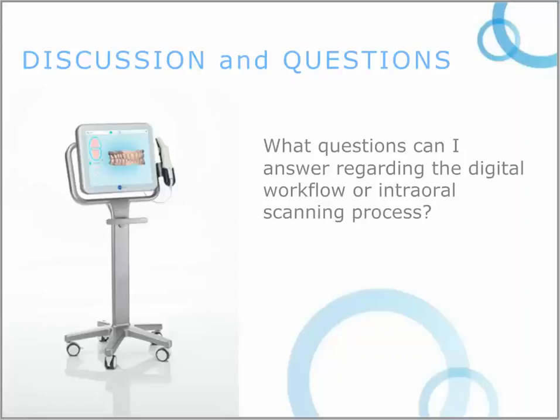Let's see what this next question says. How well does the iTero scanner do with subgingival margins, and do you still use conventional impression materials for these situations? To be very honest, we don't have any conventional PVS impression material in our office, period.